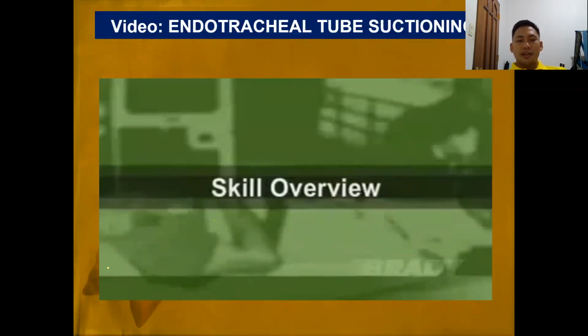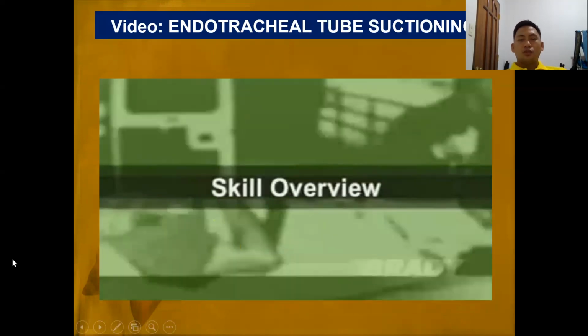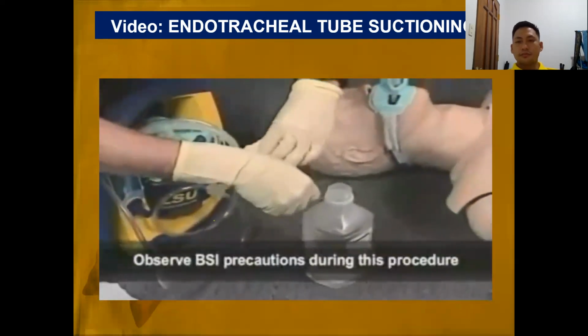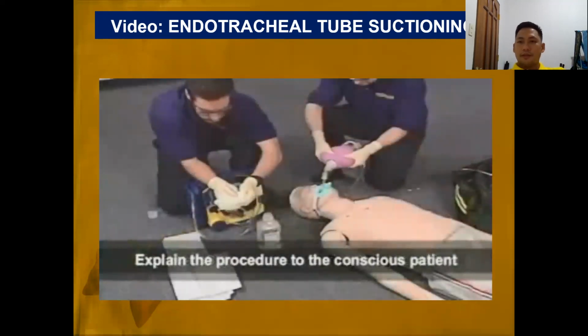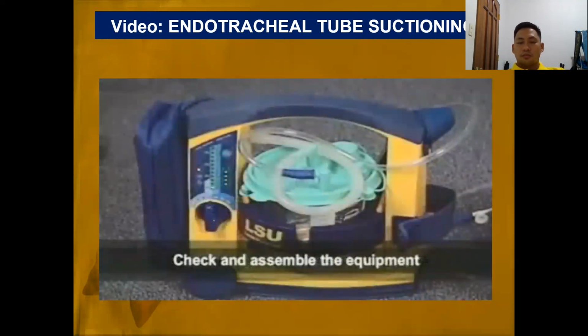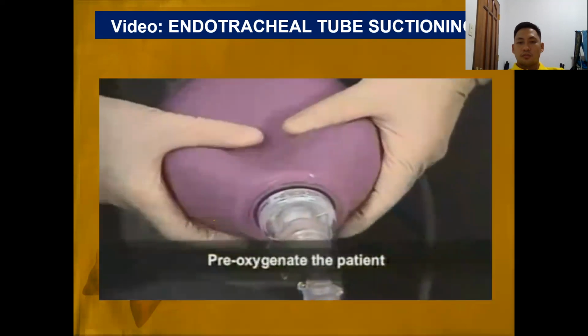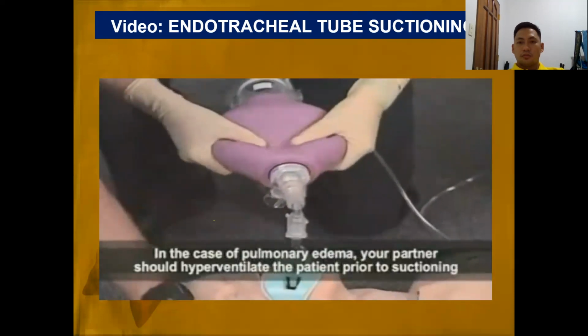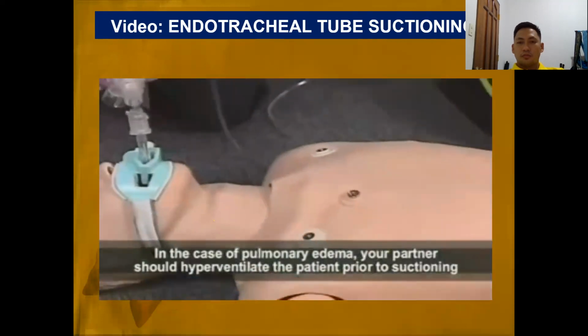Okay, so this is some skill on endotracheal tube suctioning. Now let's discuss the specific technique of suctioning through an endotracheal tube. Observe BSI precautions during this procedure. Explain the procedure to the conscious patient. Position the patient in a supine position. Check and assemble the equipment. Pre-oxygenate the patient. In the case of pulmonary edema, your partner should hyperventilate the patient prior to suction.